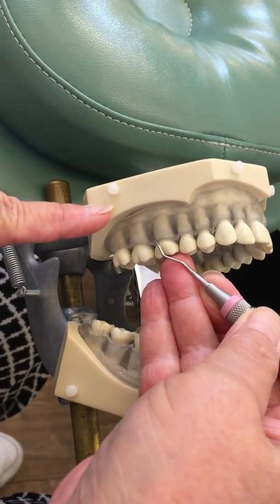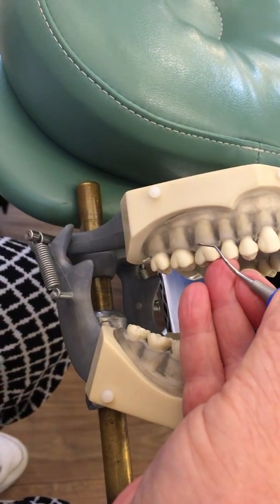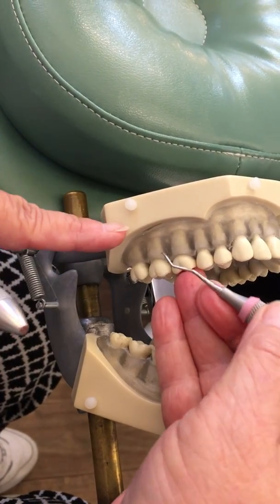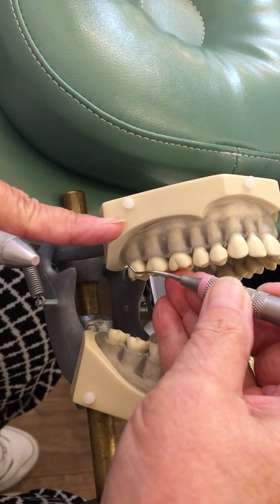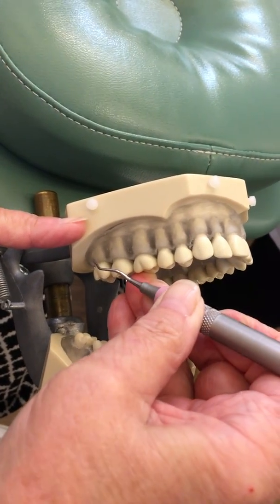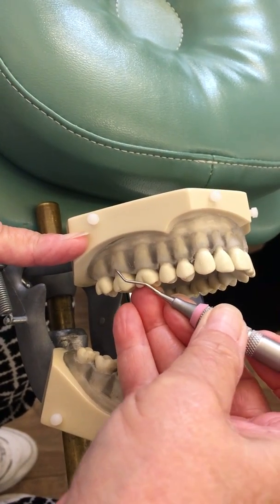I'm going to check for the right end on the distal. Placing this up — I have to stretch it up because gravity is wanting to pull me off. I'm going to roll over my fulcrum, which will put my working end or my toe at the distal of this distal-most tooth. Pulling closed, then open, and then go around the corner and move to the next tooth.